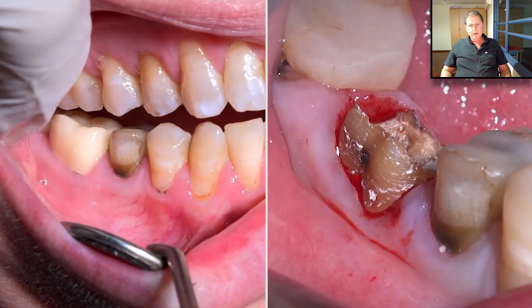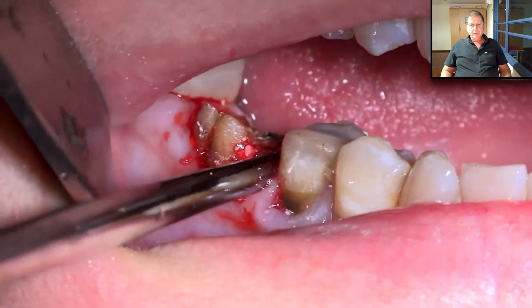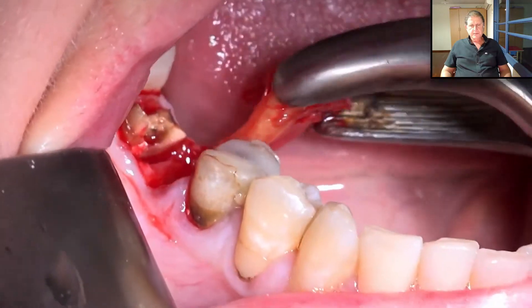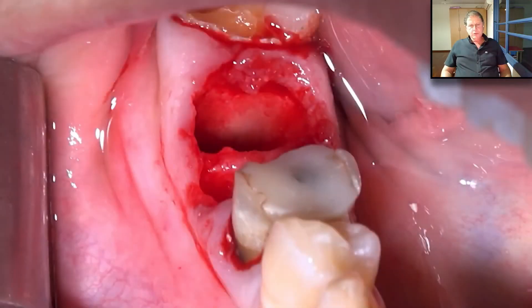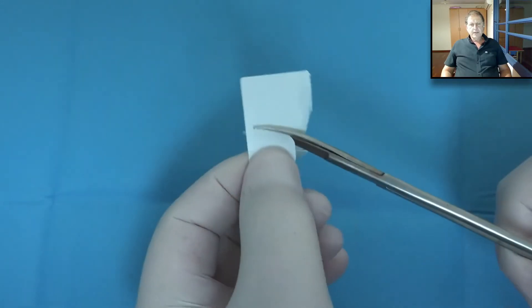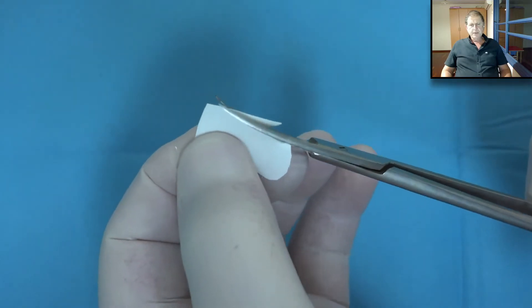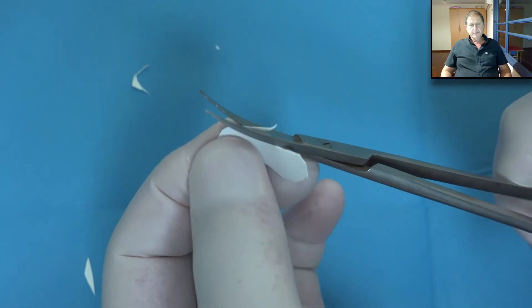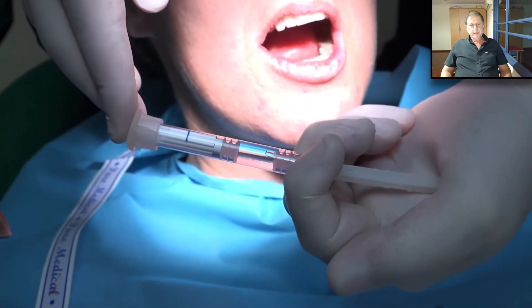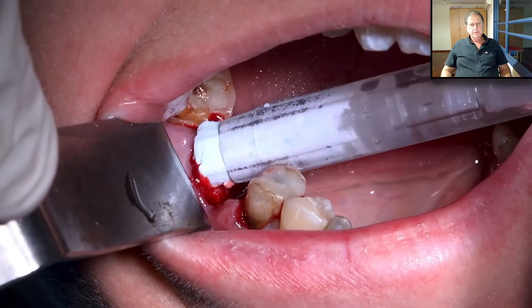Let's see this video of how we use it with Augma Bond Cement for socket grafting. Here we have a case where we need to extract the tooth. After removal of the tooth, we perform complete debridement, then we trim the shape that we need. We can take the paper from our sutures — which is sterile — and trim it to the desired size and shape. This will be our model. We check that it's exactly what we want, then we activate the Bond Apatite cement and push the shaft slowly until the first piston reaches the blue line. Now the Bond Apatite cement is ready.